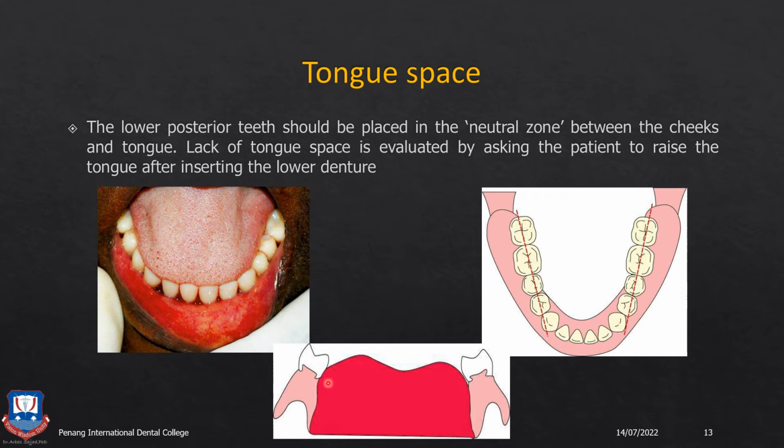And you should make sure that many times what happens is when you have a smaller maxilla, in order to get a proper class 1 teeth arrangement, you try to arrange the mandibular posterior teeth in such a way that they are lingually tipped. This results in the constriction of the tongue space, so this has to be avoided, and it will create something like this.